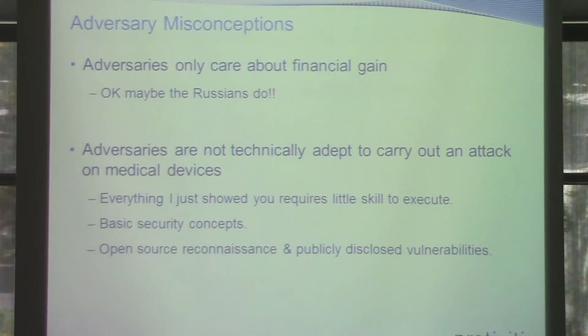There's some stuff in here too. When you get into the medical record from the patient safety side, the same weaknesses apply. Like medical identity theft, there's a lot of good research around incorrect data as a result of identity theft, leading to misdiagnosis, mistreatment, being prescribed the wrong medication, those types of things. So that's something on data integrity that we look at. It's not just a patient privacy issue, it's also a patient safety issue, because some of these devices, we can completely alter and forge records down from the devices into the patient's medical record.